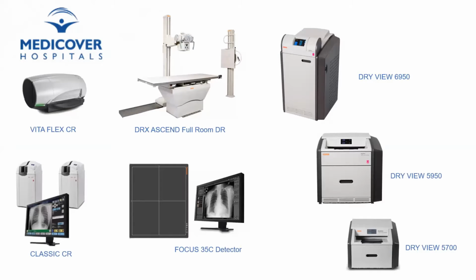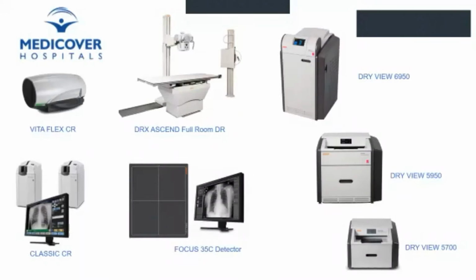These are all the equipment which we have in Medicover Hospital, which is a 400-bed hospital, biggest in our Telangana region of India. We have a Vitaflex CR and a classic CR with a reader. As I said, with CR, the cassettes have to be read in this digitizer. We have a full room DR Ascent, which gives high quality images. And this is the focus 35C detector, which we use in the X-ray room, as well as take to the bedside and do all our bedside work. And these are the printers. Next slide.